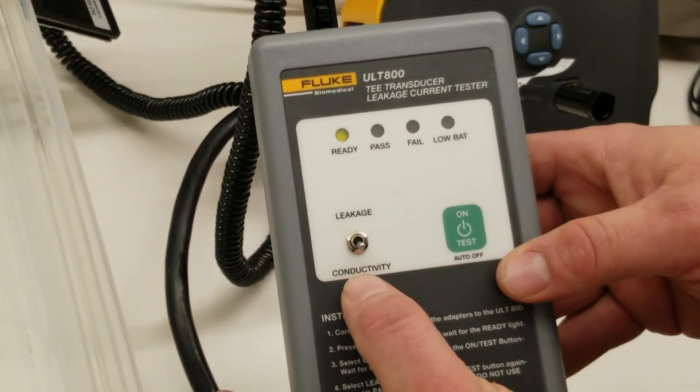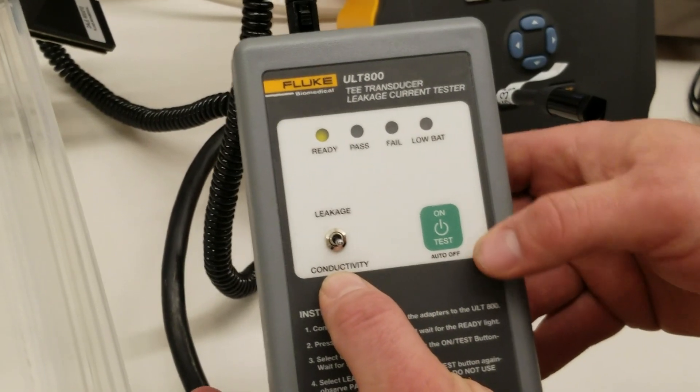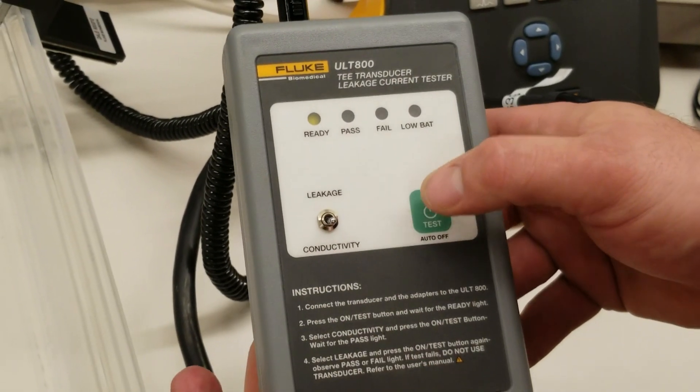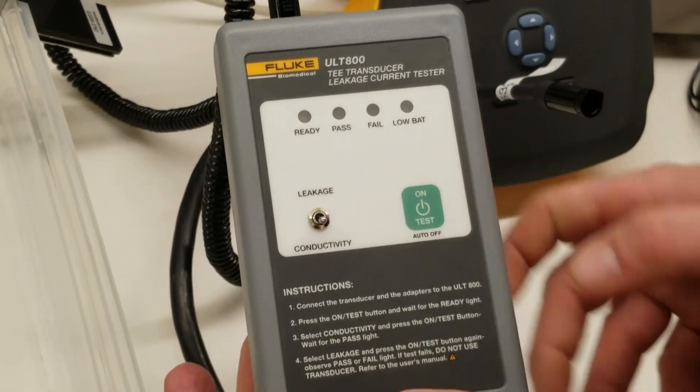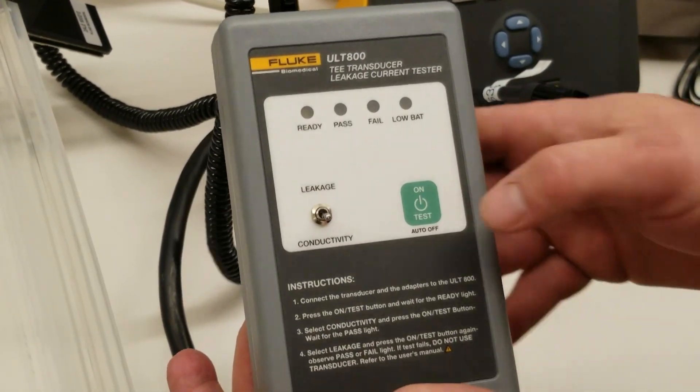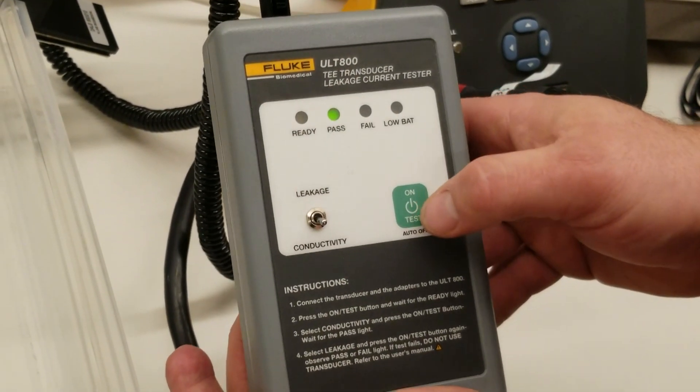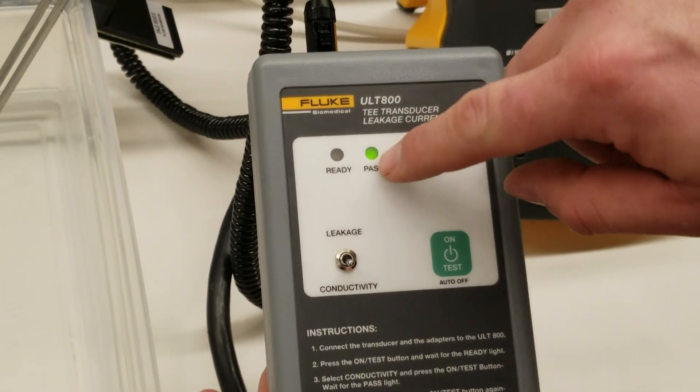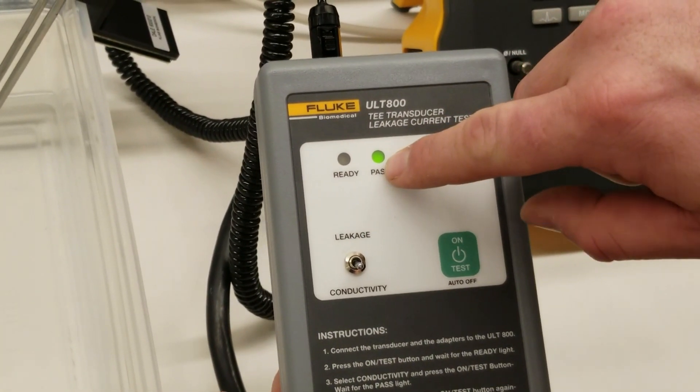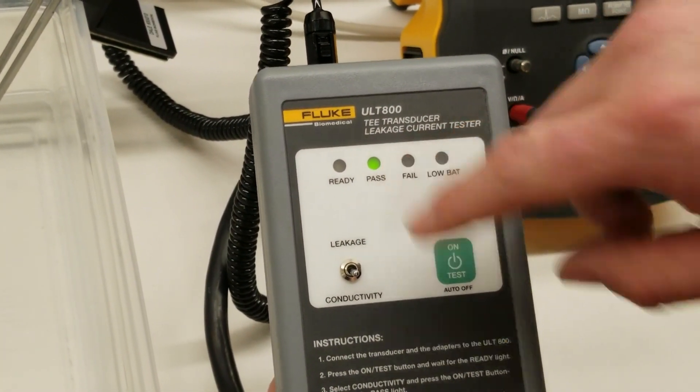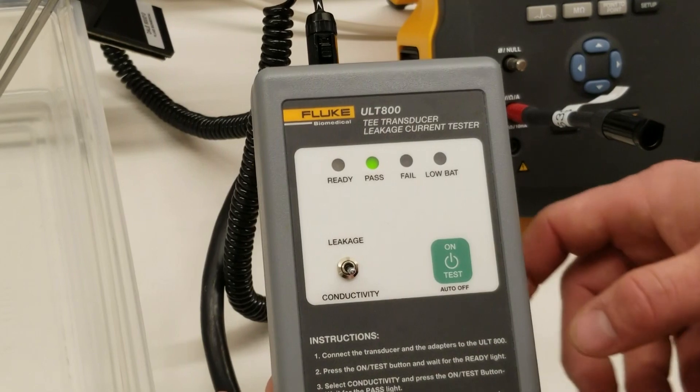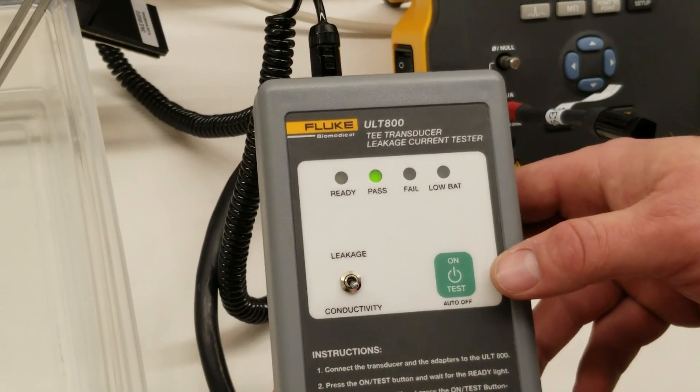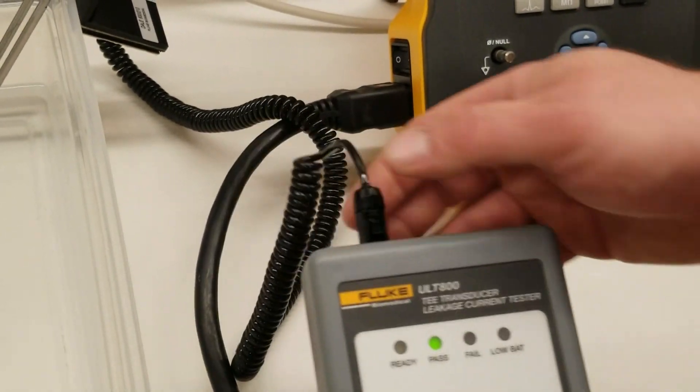So we'll set the ULT 800 on conductivity, push on test. It's going to go through and test itself once, and then the next time you hit it, it will say pass. So that means we have passed the conductivity test.